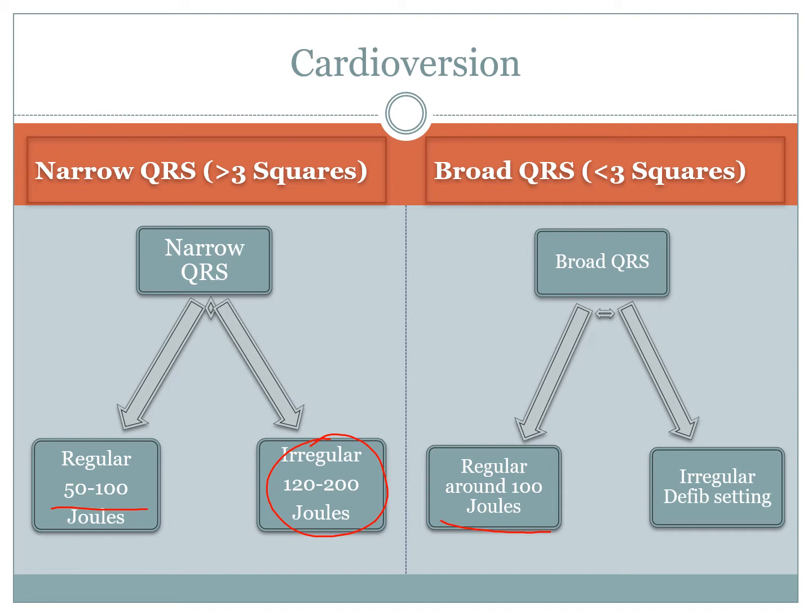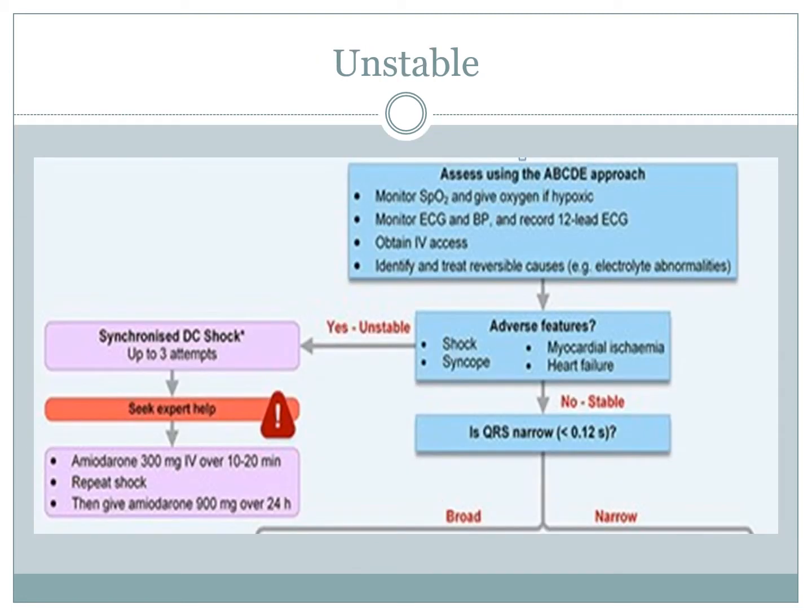Now that's obviously down and dirty, something you need to talk to the staff that you work with in order to practice cardioversion. It is pretty simple, granted, but it's still something that needs to be practiced. And you need to start talking about what sort of things you're going to use for sedation. Once you've gone through the cardioversion and it doesn't help, then that's where you need help. If the cardioversion didn't do what you wanted it to do, then you need to seek advice.